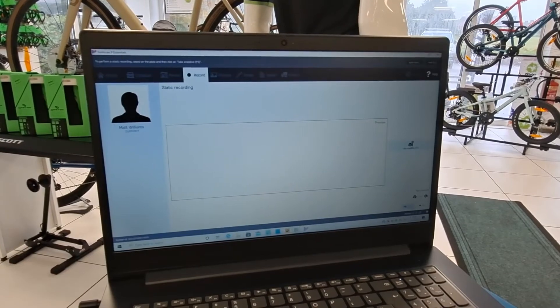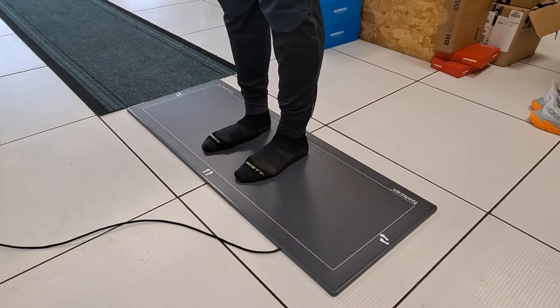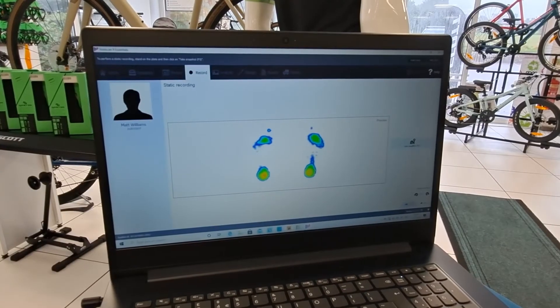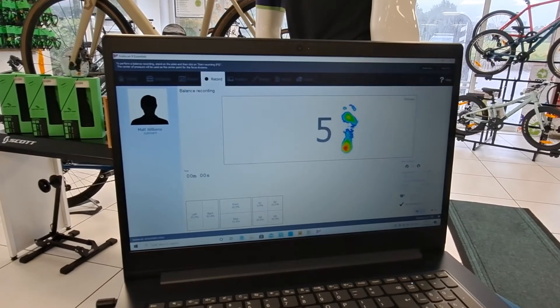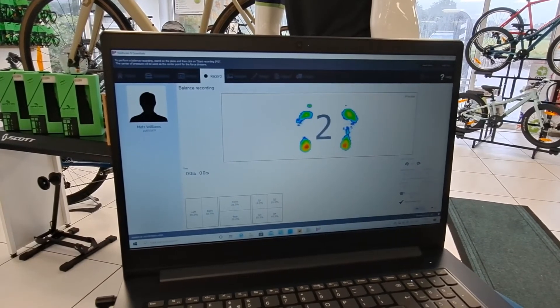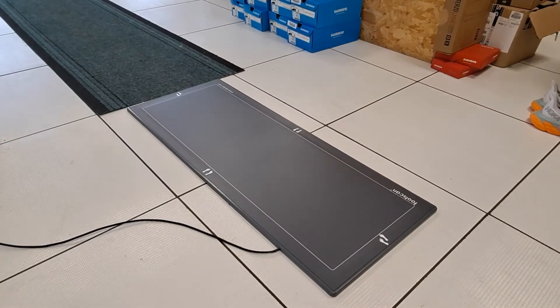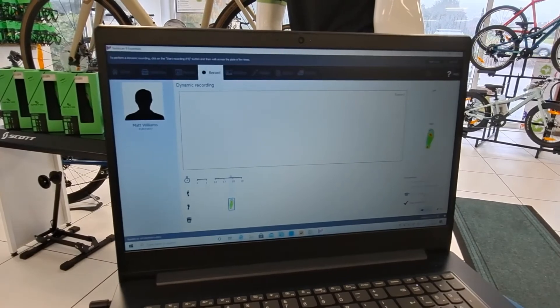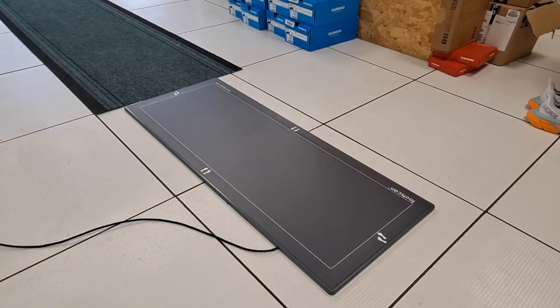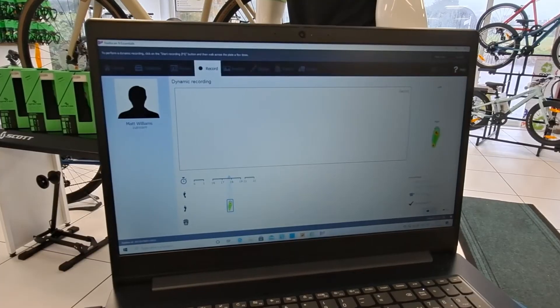The analysis is made up of three parts. The first part is a static test where people just stand onto the footpad. The second phase is a balance test. The final test is a dynamic test where you run over the footpad, and it will take a reading three times per leg and then calibrate it to get the correct results.